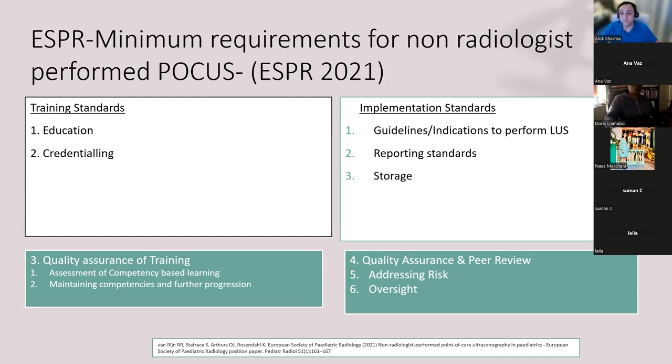We sometimes have real confusion with whether there's free air in the abdomen with very small amounts, where we have to do decubitus views. Now, we might not have an available pediatric or adult radiologist to come and help us interpret those x-rays. And we really have to do that based on our clinical judgment, our assessment of the baby at the bedside, but more importantly, using a great and important tool of clinical correlation, looking at the baby, which the radiologist does not have.